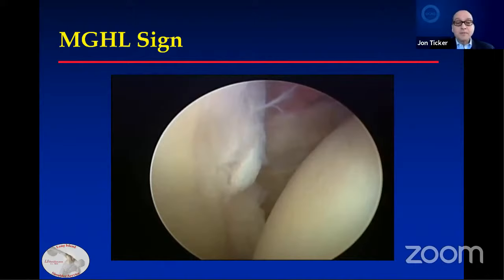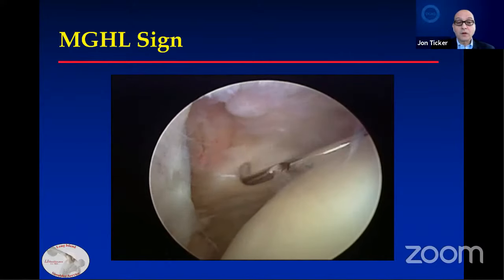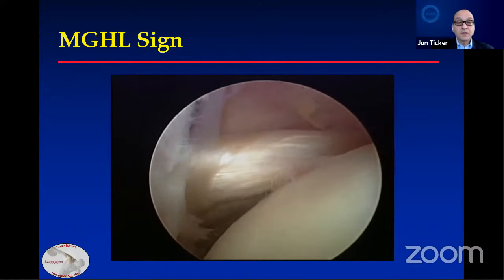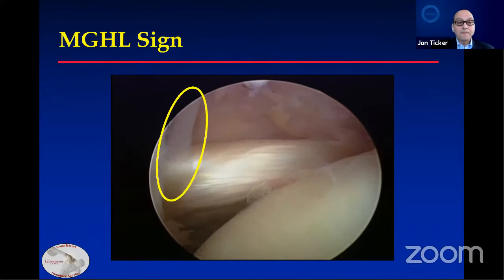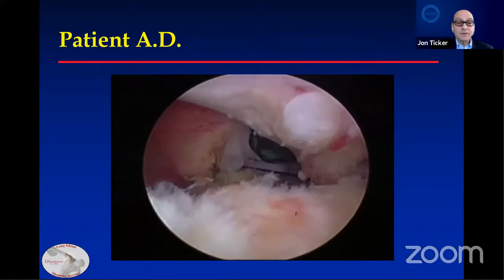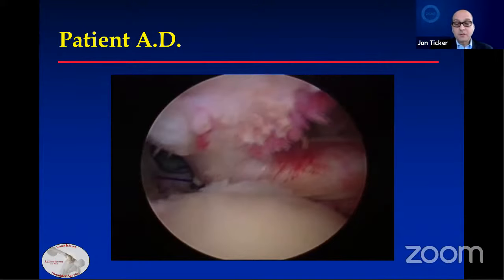Just another example — a right shoulder viewing from posterior, with the glenoid on the left and the humeral head on the right. The probe shows the leading edge of the comma tissue. I hook into the subscapularis and bring it laterally. Here is a diminutive middle glenohumeral ligament. Back to our patient AD, viewing a little more laterally, with the supraspinatus right over the humeral head. As I pull the subscapularis laterally, the supraspinatus is coming more laterally — that's an essential feature.